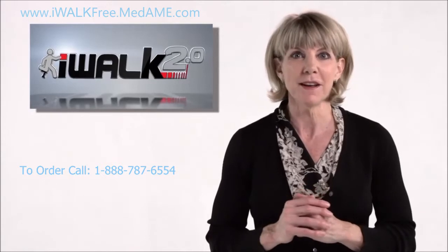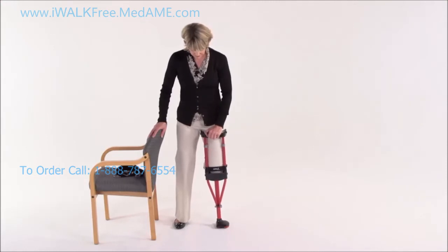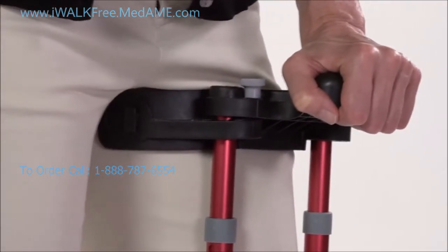Now follow along with me. We'll make both adjustments at the same time. Take the handle and tilt the top of the crutch inwards until you can feel that both of the treads are touching the ground. Test it a couple of times by rocking the crutch outward then back inward.